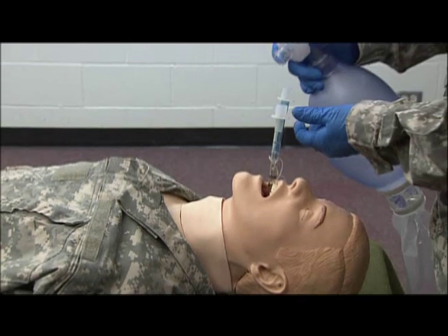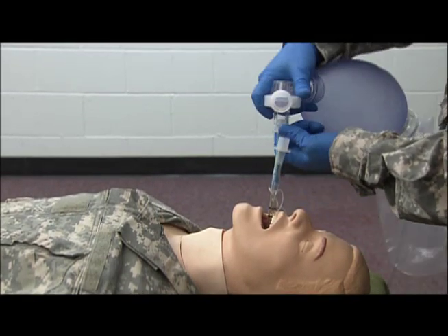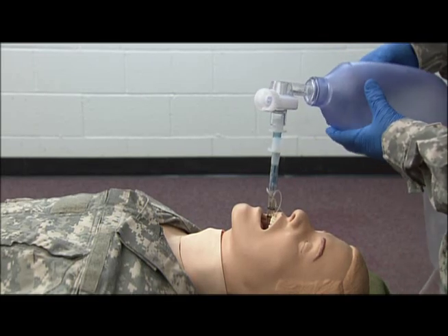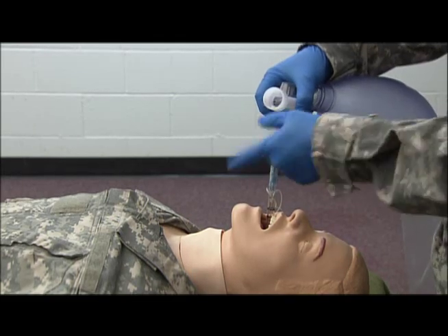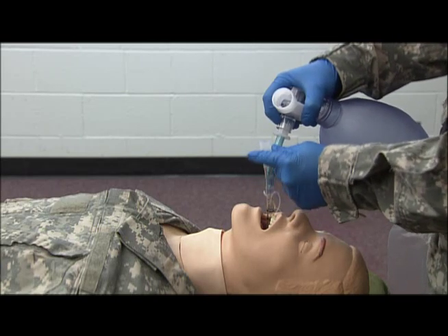Now, I'm going to take my BBM and first hook it up to the blue adapter up top to check to see if I have rise and fall to the chest. I do with the blue connector. If I did not, I would immediately move over to the white adapter.